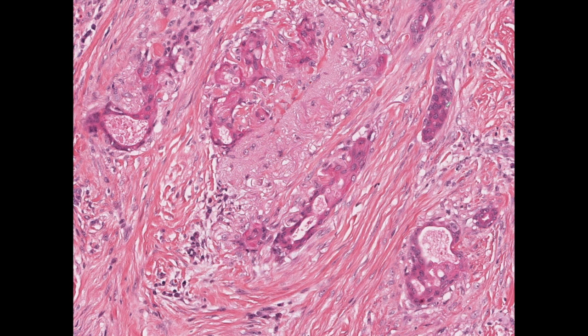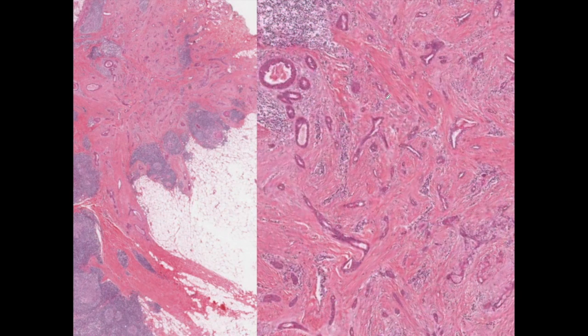There are several small foci showing mild nuclear atypia. The cells have abundant pink cytoplasm. Nuclei are mildly pleomorphic. No vascular or perineural invasion is seen in the lesion. In summary, we have an infiltrative neoplasm in the dermis and subcutaneous tissue, characterized by tubular and microcystic differentiation of eosinophilic cells within a sclerotic stroma. Nuclear atypia is very focal.